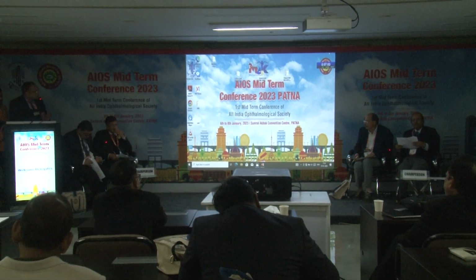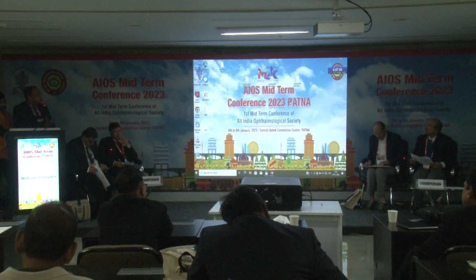One of the tables you showed had the clinical parameters, and then one column, then another column. I was wondering, but I couldn't read that properly. That was the disease schema. It covers all the disease schema regarding glaucoma, diabetic retinopathy, hypertensive retinopathy. So all the common ocular diseases were validated. Okay, thank you. And for validating one disease, a minimum of 5,500 images were considered as per the statistician.